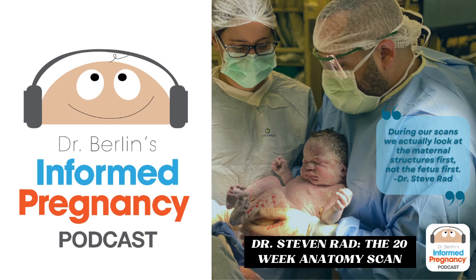Yes. Then I typically look to see that there's a 3-vessel umbilical cord. So there should be 3 vessels in an umbilical cord. One vein and 2 arteries. Correct. And you can either look at that by looking at a piece of the umbilical cord in cross section, and you can actually see the 3 vessels, or you can look at the blood vessels around the bladder, the 2 arteries around the bladder, to be present. And then you know that there's not what we call a single umbilical artery situation.